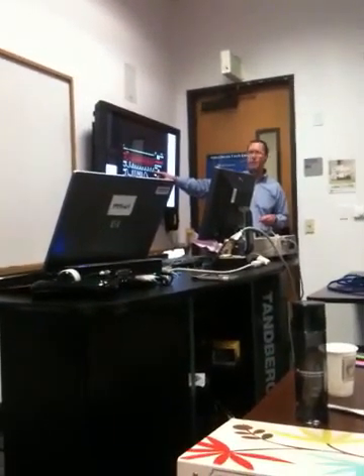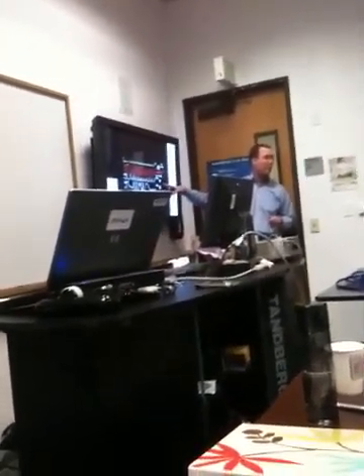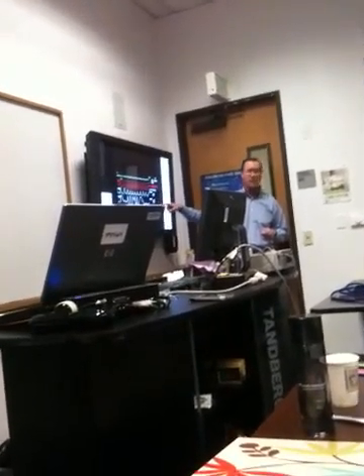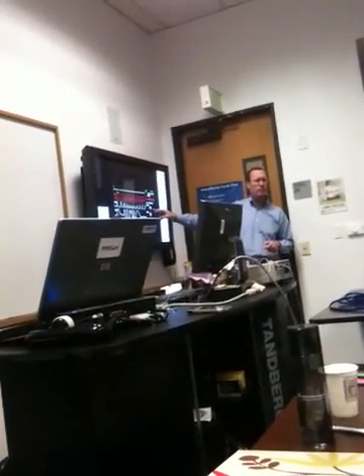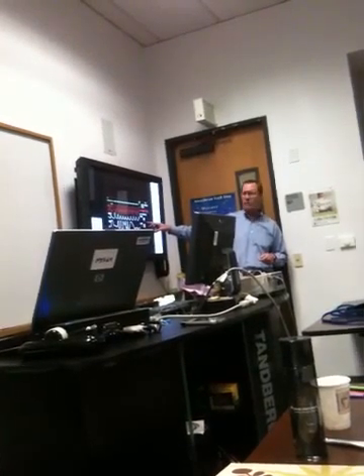If you had a nice strong pulse like this and a lousy saturation, you'd have to think, oh, that saturation's not good because I've got a good pulse, and in spite of a good pulse, the saturation's not good. If you've just got something that's kind of real weak here and the saturation's not reading well, you've got to think, well, maybe that's artifact. I need to look into that some.